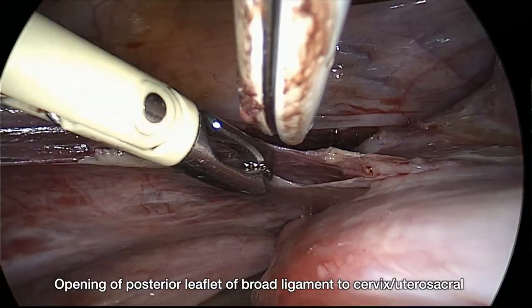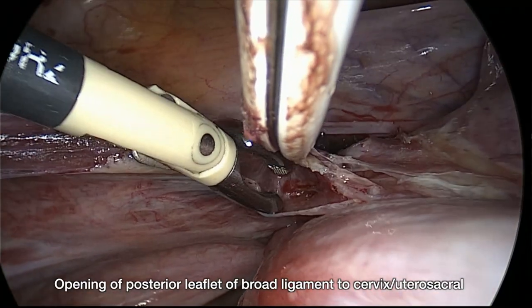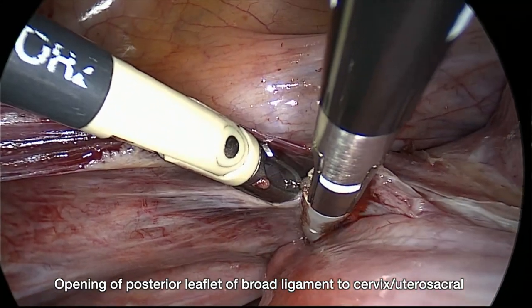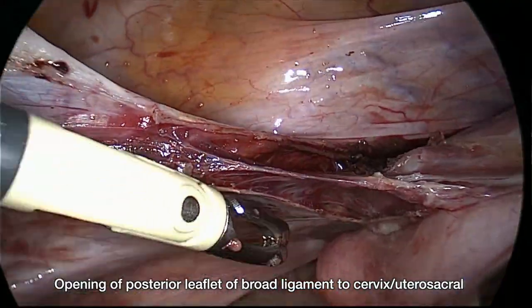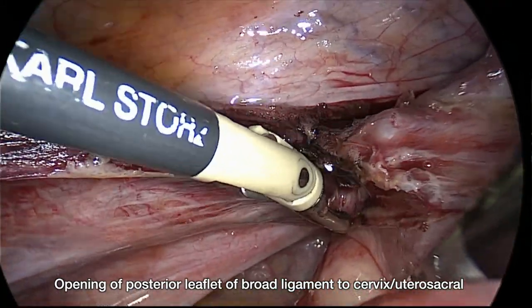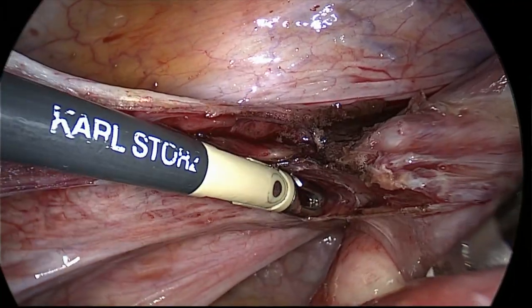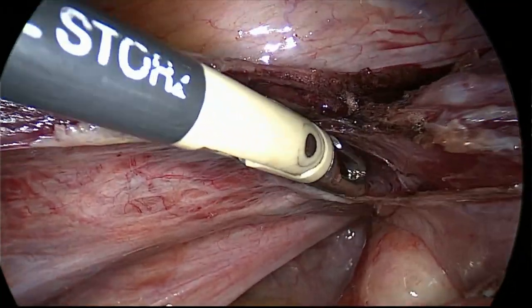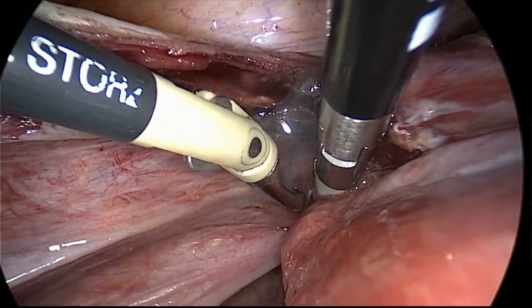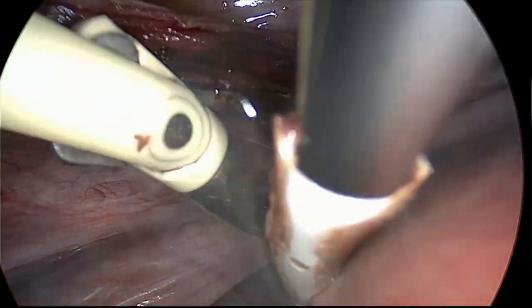It is also relevant to open the posterior leaflet of the broad ligament up to the cervix and uterosacral ligament, in order to isolate the uterine vascular pedicle from a posterior approach as well.